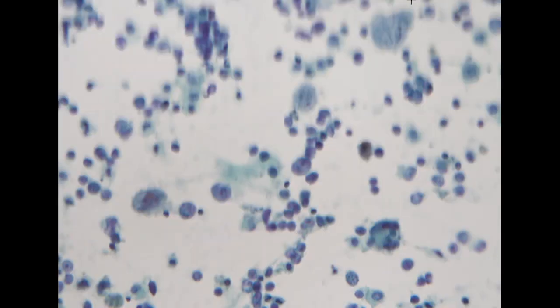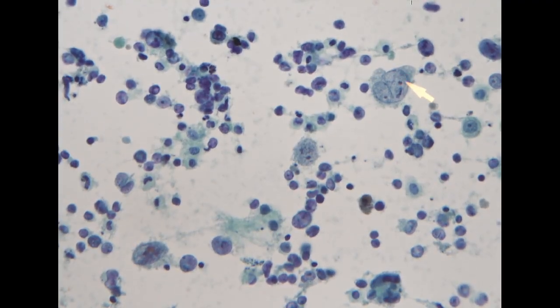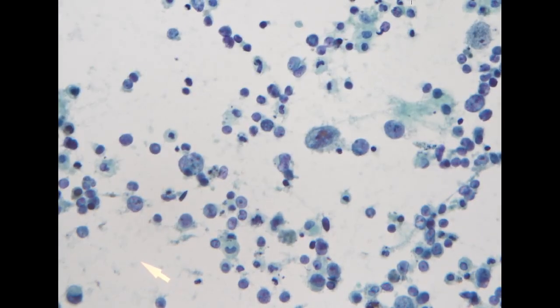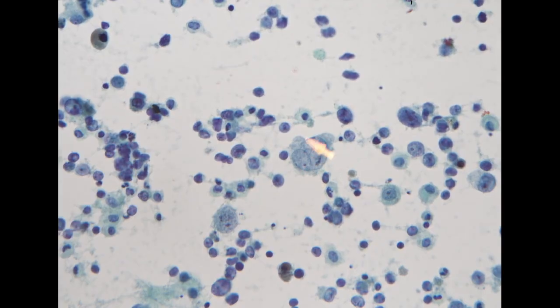However, when we go to higher power, you can appreciate that in the background, there are some very big cells with a relatively loose or pale chromatin pattern. The shape of the cell is very bizarre. This looks like an embryo, and the NC ratio is relatively high. So this is pretty eye-catching because these are really big.